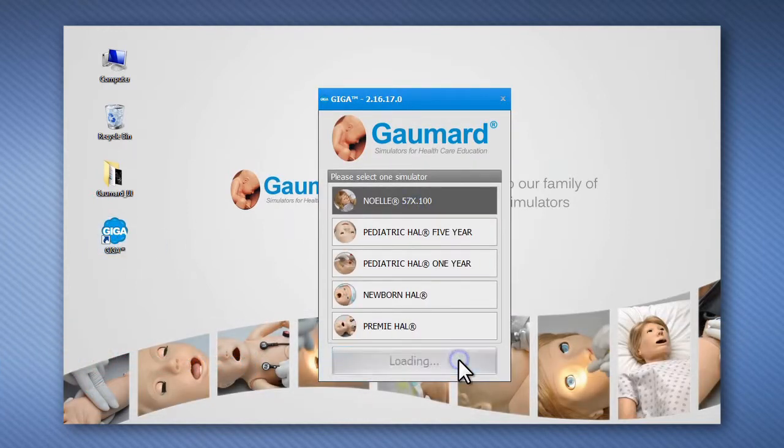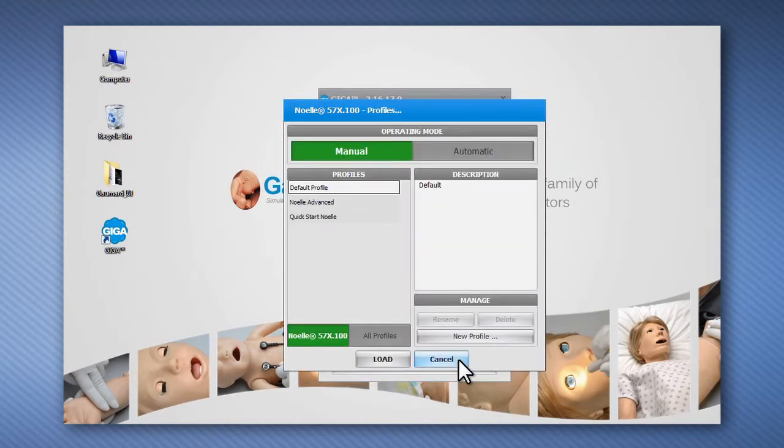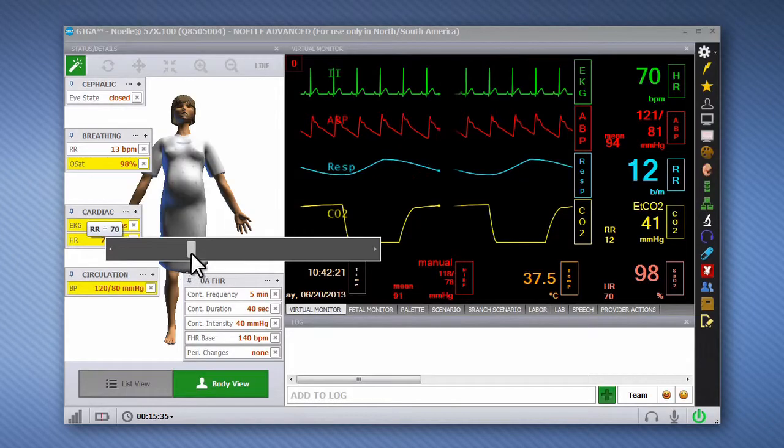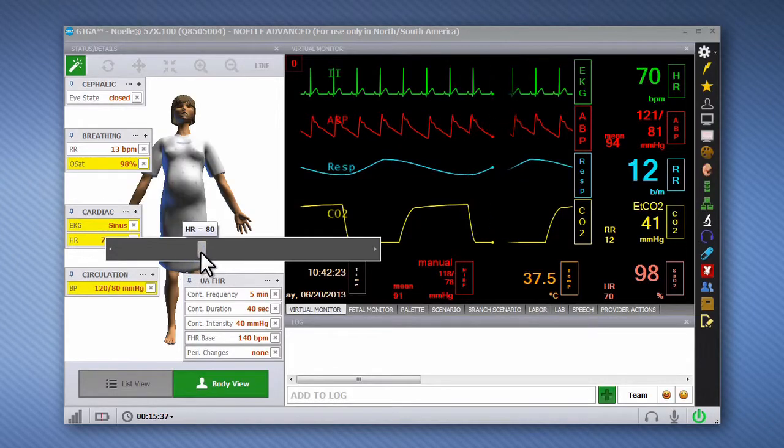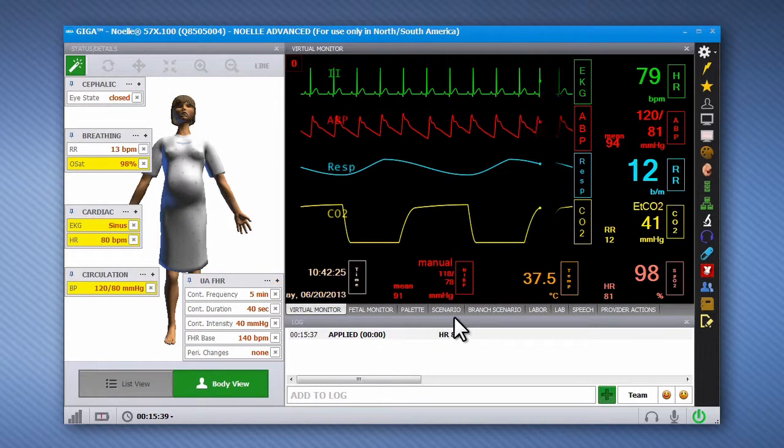The GIGA Simulator Control software has two modes of operation. In the manual operating mode, vital sign changes are controlled manually using the on-the-fly controls or by programming scenarios.